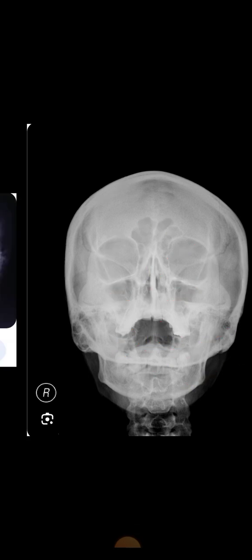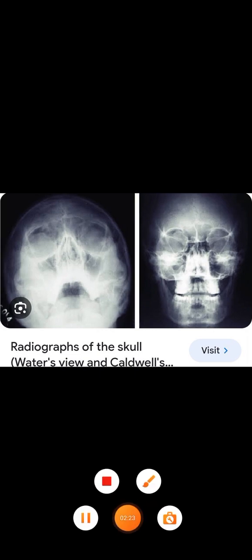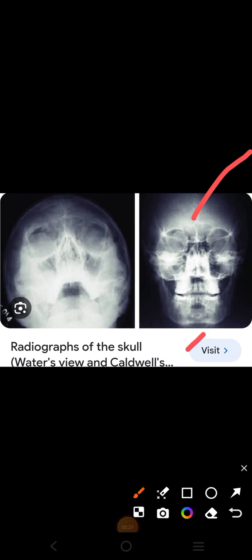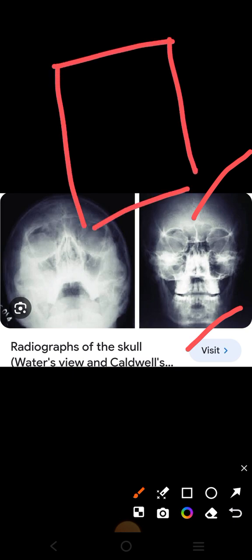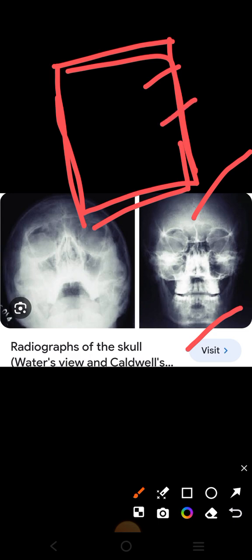Next is Caldwell's view. In Caldwell's view, you ask the patient to place their nose and forehead touching the film. This view is best for seeing the frontal sinuses, which can be seen easily here. Other sinuses can also be seen, but this view is mainly used to see the frontal sinus.